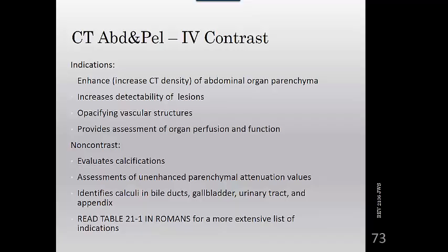And like I said, for studies that show the mesenteric vessels, it's very important to use that for CT angiography of those vessels, because if you use regular barium, then you'll kind of obscure the mucosa, and you might even miss some vessels that are traversing through there. Few institutions routinely administer rectal contrast material, but it can be done. When it's used, the most common indication is colon cancer staging.